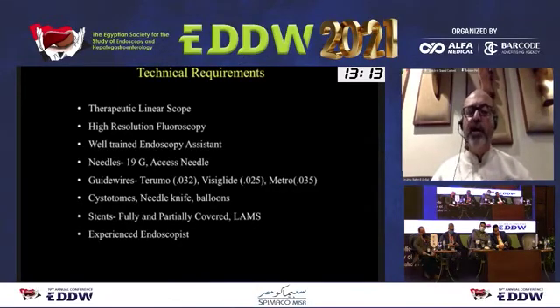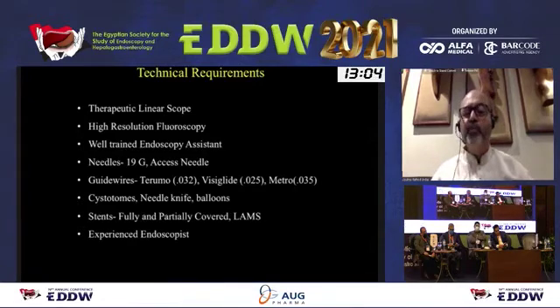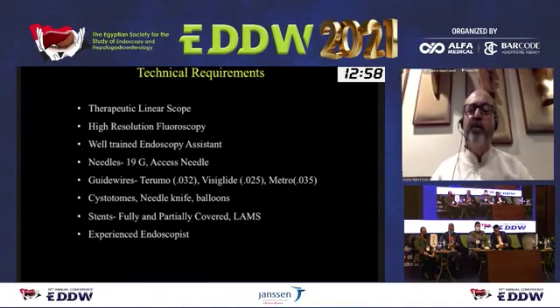Of course, you need needles, guide wires, cystotomes, needle knife, balloons, and of course stents: plastic, nasobiliary drainages, and lumen-apposing metal stents. And on top of everything is a very, very experienced endoscopist.